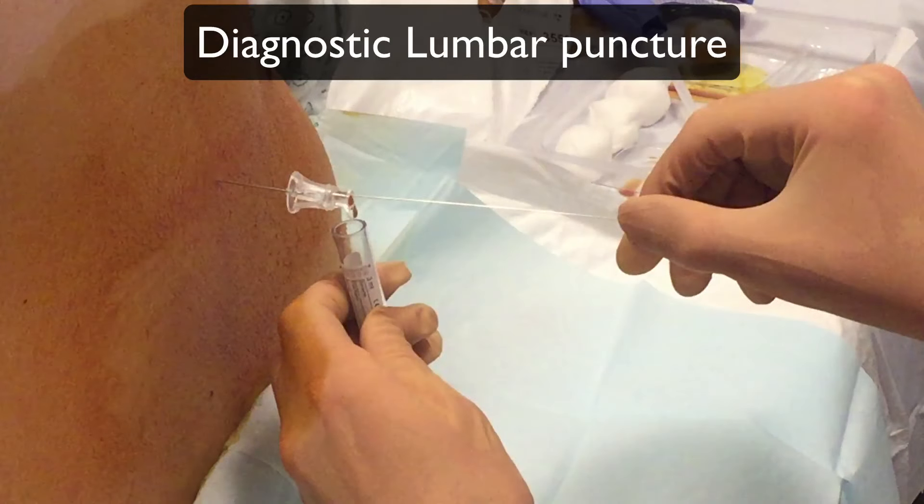Welcome. In this video we will show you how to perform a diagnostic lumbar puncture.